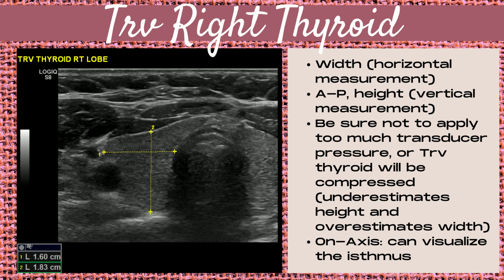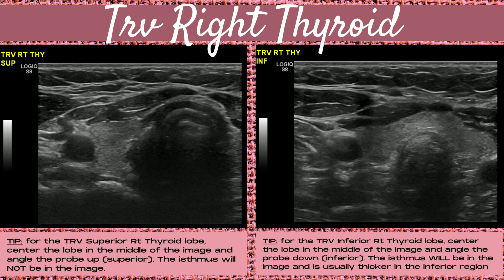Ensure you're on axis and can visualize the isthmus, and also ensure that your height measurement does not include the isthmus. For the transverse right thyroid superior pole, center the lobe in the image and angle the probe upwards — the isthmus will generally not be visible. If you do see the isthmus, you generally haven't angled up high enough. For the transverse inferior right thyroid lobe, center the lobe and angle the probe downwards. The isthmus will be in the image and is usually thicker in the inferior region than in the middle segment.